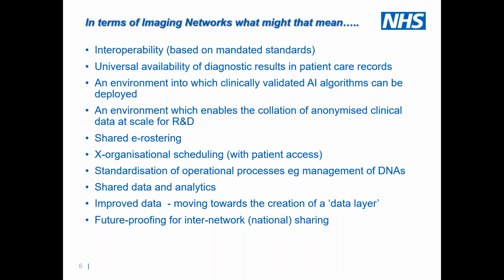Specifically in terms of what NHS England and Improvement are looking for, there's two very specific metrics on the bottom there. We're looking for networks to be able to do what we term a global patient search. You could also regard it as creating a single patient history, so that I can sit in my hospital in Bradford and know what other x-rays have been done in other hospitals in the network. And once I can see them, I can get them, okay?